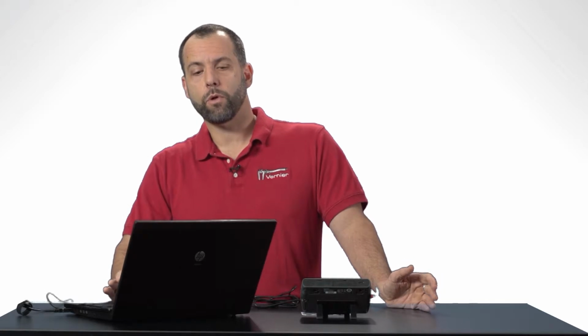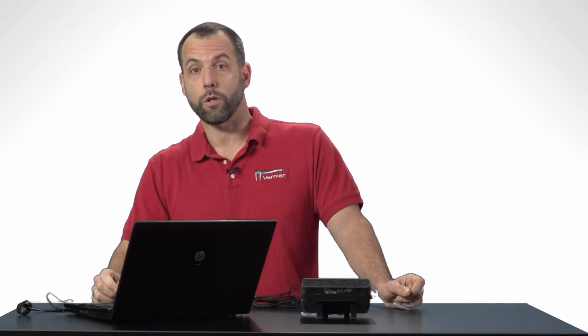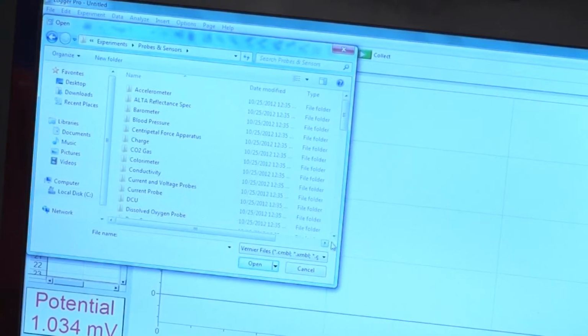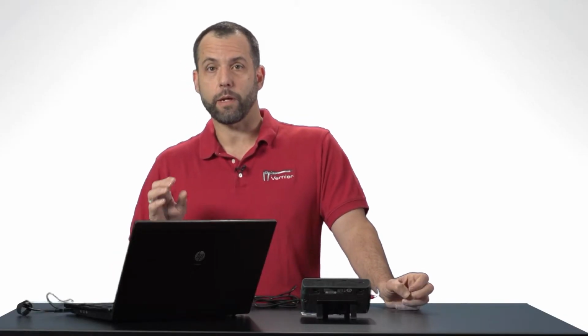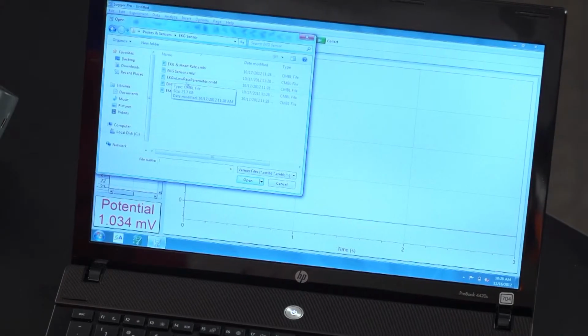Now, in this folder there are a whole bunch of other folders for each sensor. We have special little files that are located in this folder. You want to go down and find the EKG folder. So I'm going to scroll down here and find, here's the EKG Sensor folder. And I'm going to open that up. Now what we have here in this folder are several different files. And the one that I'm going to open up is called EKG with Low Pass Parameter. What that is, is it's a special file that applies a low pass filter to the EKG trace. So I'm just going to open that up.